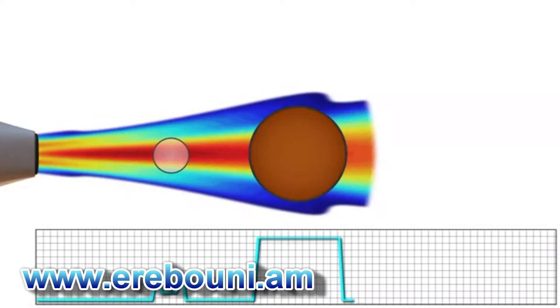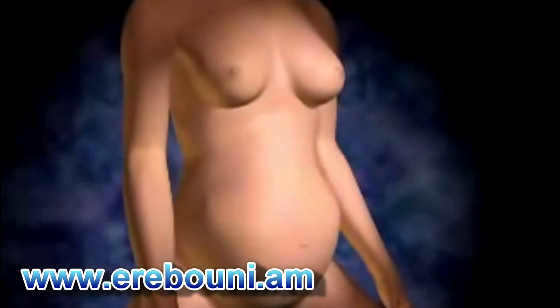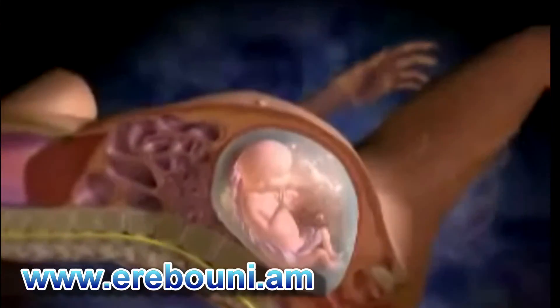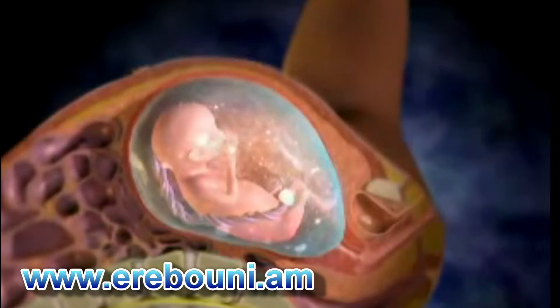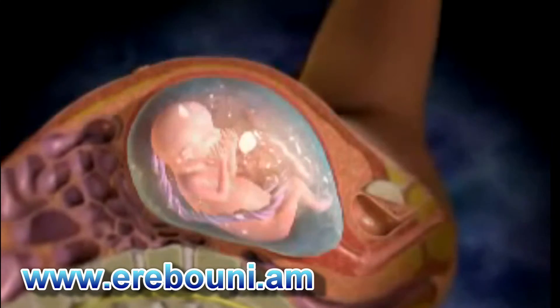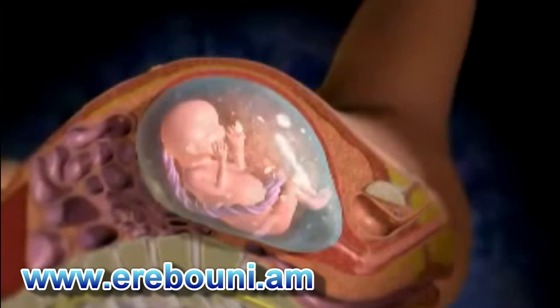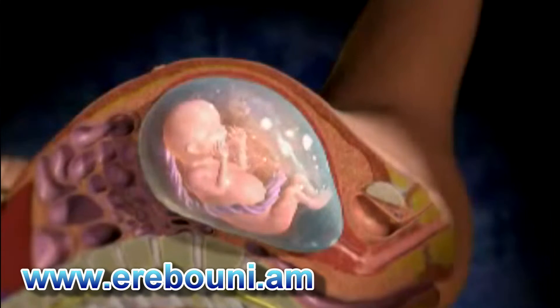Part of the sound energy is reflected by the tissues and part continues to travel through until it hits other tissues and is reflected back. The image is produced from the reflected sound waves as they come back from the different tissue interfaces, and that impulse is registered on the screen as a dot. Thousands of these dots produce the complete image, which is a composite of all the returning signals.